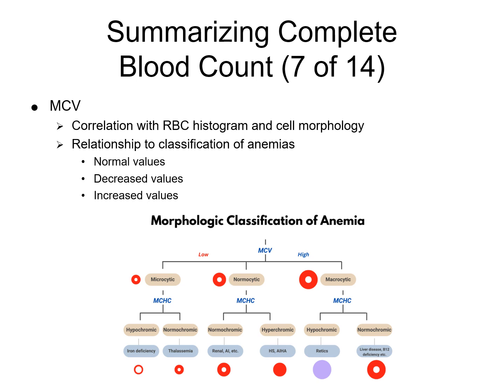Again, normal range is between 80 and 100. A decreased MCV could be caused by iron deficiency anemia, thalassemia, chronic disease anemia, or sideroblastic anemia. An increased MCV could be from vitamin B12 or folate deficiency, liver disease, alcoholism, hypothyroidism, or even just certain medications.